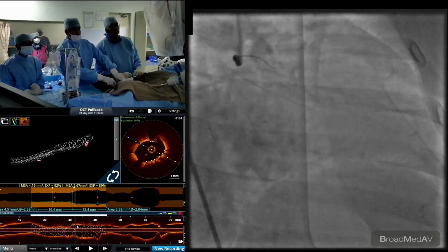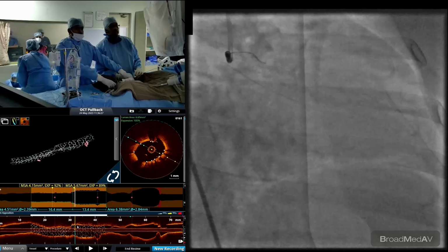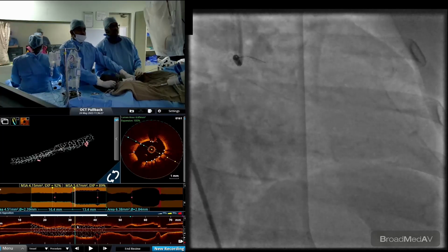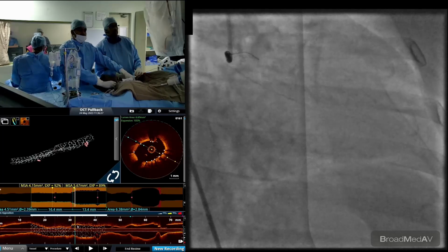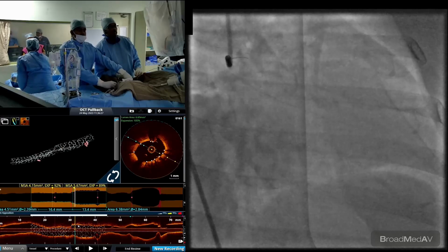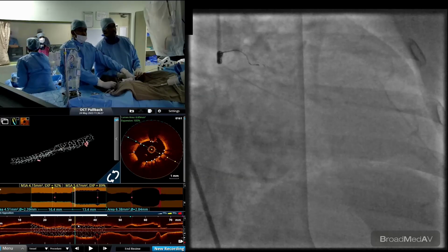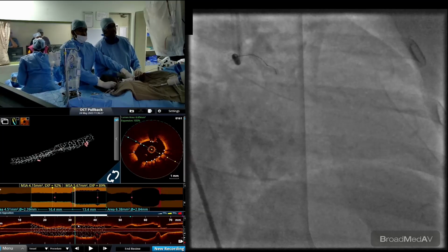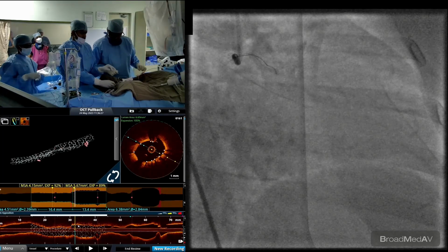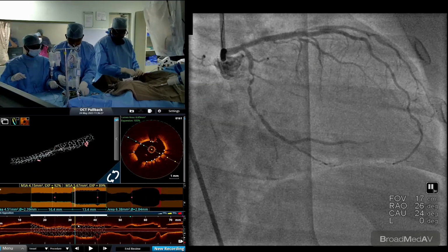Yeah, I think the vessel looks a little small. Yeah, a little big enough. No need for imaging. We can go ahead with the angiographic guided predilatation and stenting. So I feel it's going to be BMW again. Let's keep it simple. It may be a little tricky to track down the OCT catheter through this anomalous LCA and this LCX. So we'll stick to angiographic guided PCI.